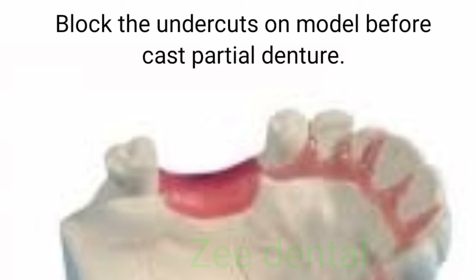Viewers, in this picture you can see the use of the block-out wax. Block the undercuts on the model before casting the partial denture. And this wax is used for clasp attaching on the model.